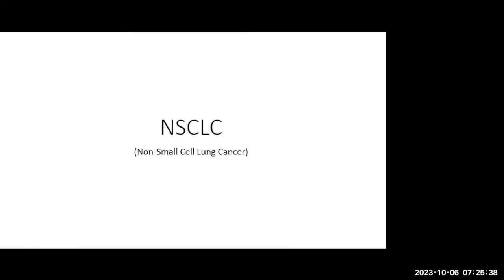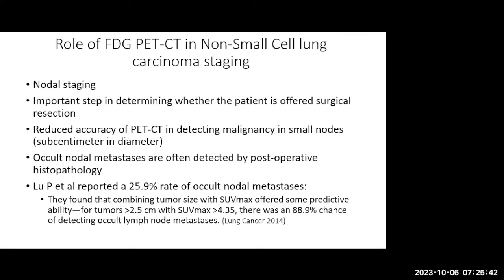So moving on to specifically non-small cell carcinoma, what is the role of FDG PET, right? For staging, which is the first step, and here the patient has already been diagnosed, so we're beyond the single pulmonary nodule stage. So very, very important is nodal staging. It's a very important step in determining if the patient could be offered surgical resection.